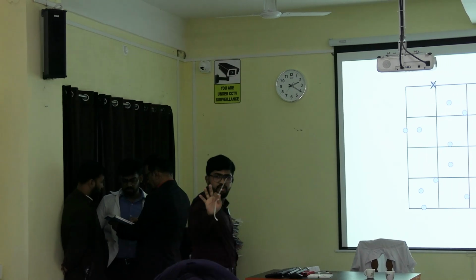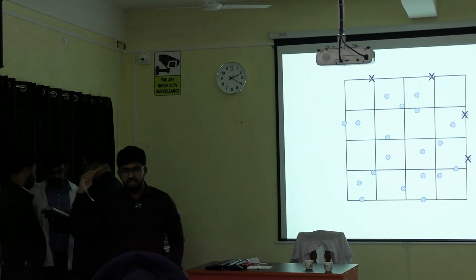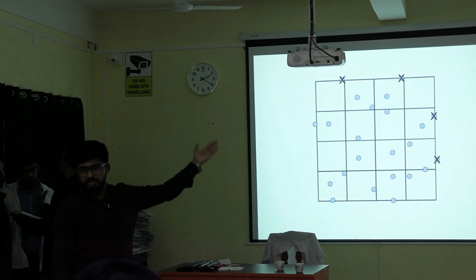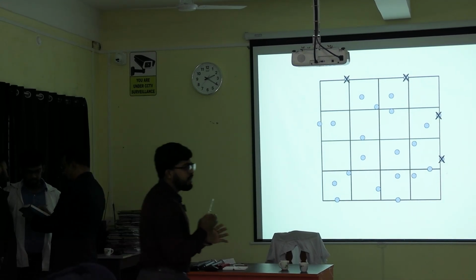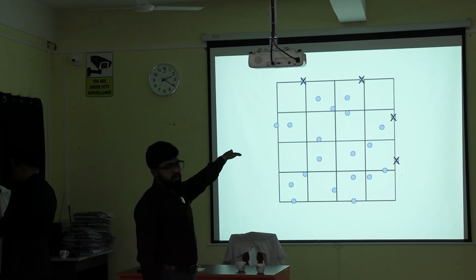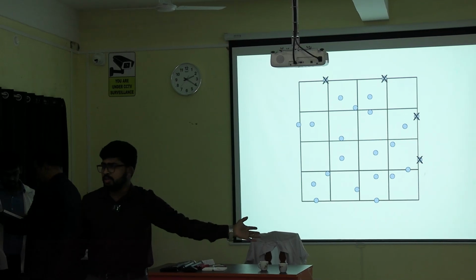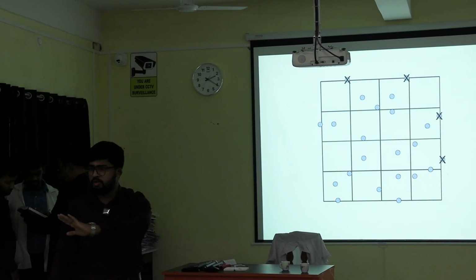Okay. So the cell count is 19. You have to use your eyes only, nothing else. In this case, you don't need to use your brain. You only use your eyes. The cells that shouldn't be counted have been given a cross already, the right one and the upper one. So what cells are you counting? Only the cells that are not crossed. And there are 19 cells actually. Not 18, not 16, and not 17 also.